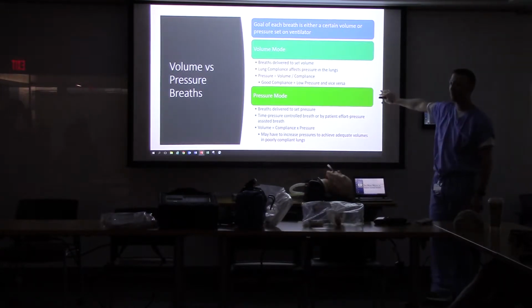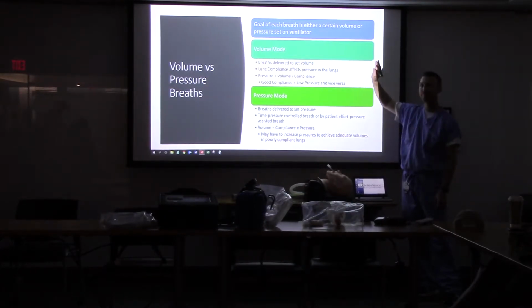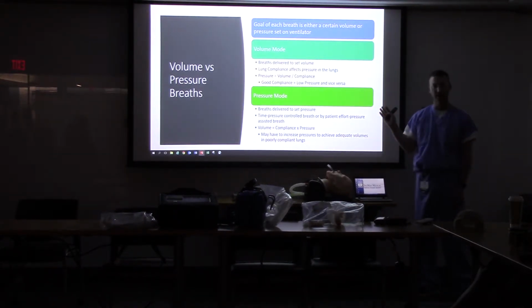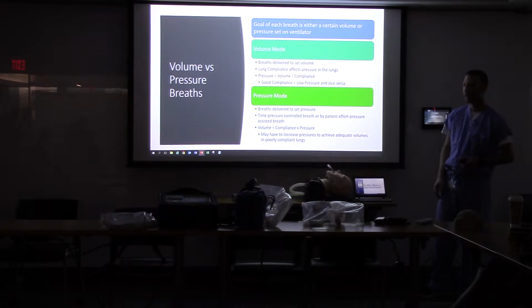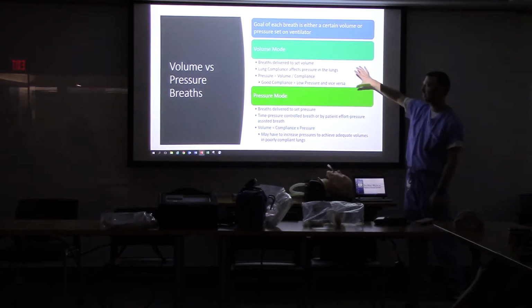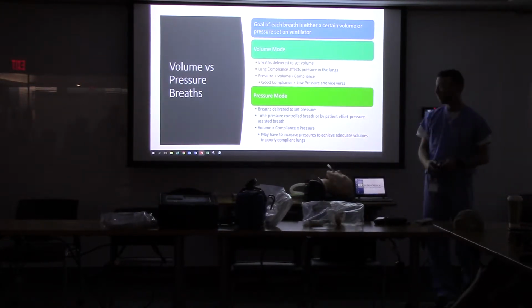So, any questions on goals? I'd say 98% or 99% of emergency department patients are placed on volume mode because we are seeing a trend and a slight benefit to setting patients on the volume mode as opposed to a pressure mode. You'll generally see a patient on assist mode, which is where the patient can draw in their own breath, and they'll say the goal is volume as opposed to pressure, and then we'll tweak it some more after that.